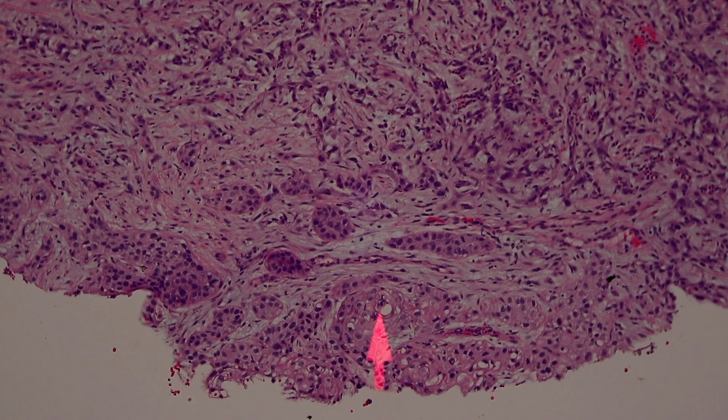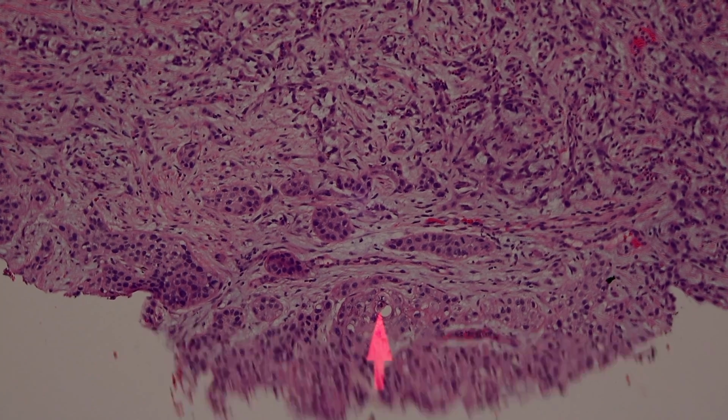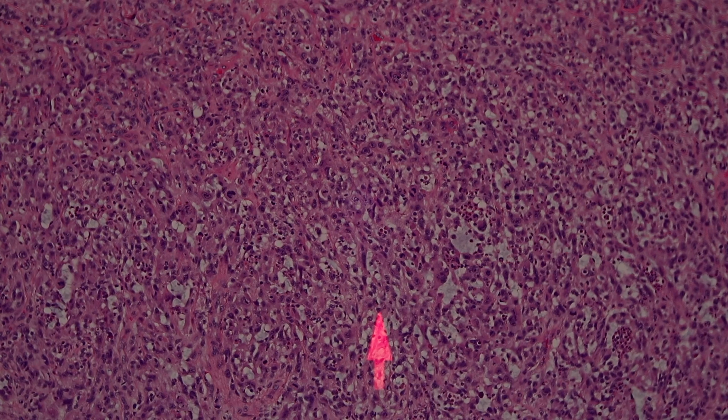But that said, it's been reported that you can have melanomas and squames grow next to each other. You can have atypical fibroxanthoma or pleomorphic dermal sarcoma grow right next to squamous cell carcinoma. The most likely thing is that this is a squamous cell carcinoma that's turning into an ugly high-grade tumor. But if I have any doubt, doing some stains can help.